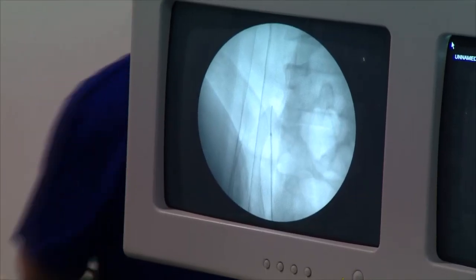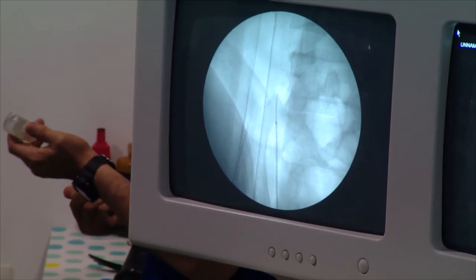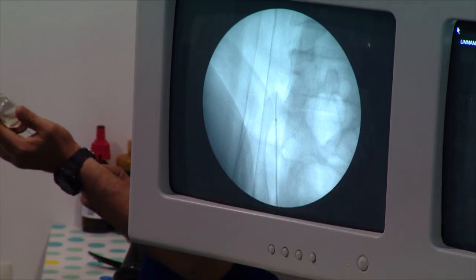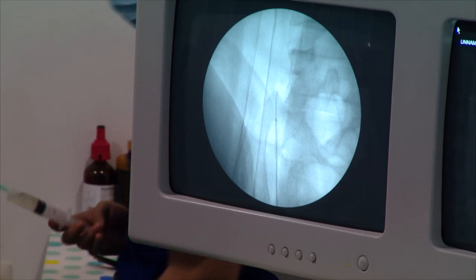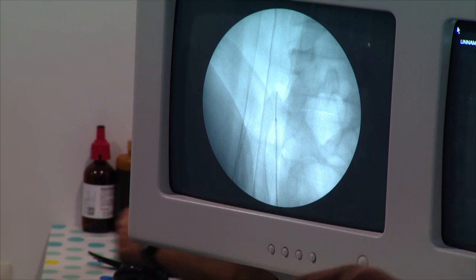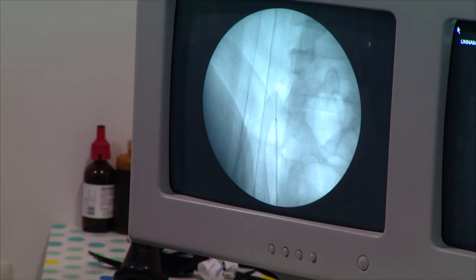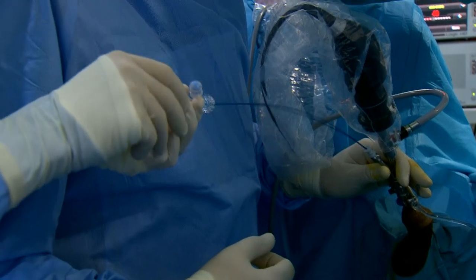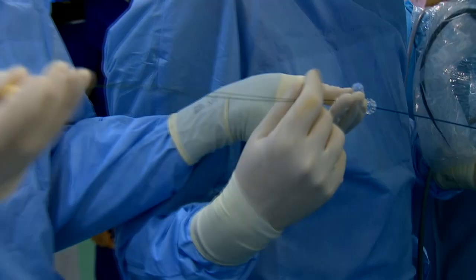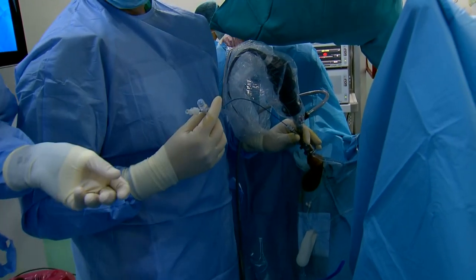Now we are removing. Camera. Now we are removing the yellow device. We need a camera over there, from your position. Okay, now the special guide wire is removed. And now we apply some contrast dye.